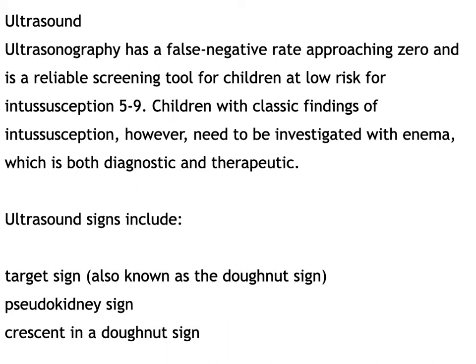However, children with classic findings need to be investigated with enema, which is both diagnostic and therapeutic. This is very important, diagnostic and therapeutic, because with this enema you can solve the problem. But this study should be done in combination with two things: the radiology team and the surgical team. They should be together in case of any complication.